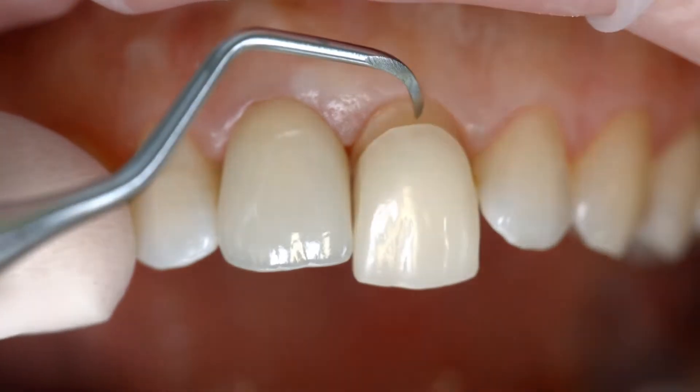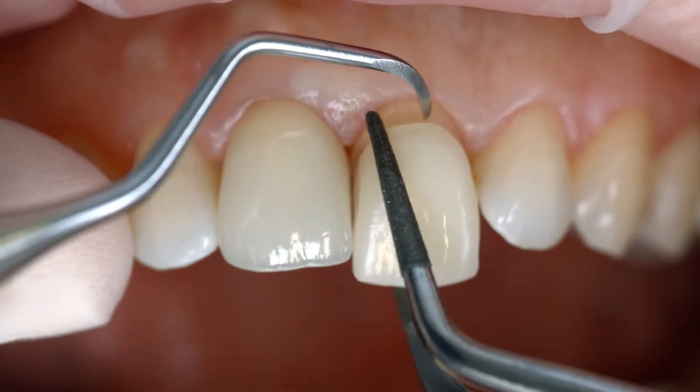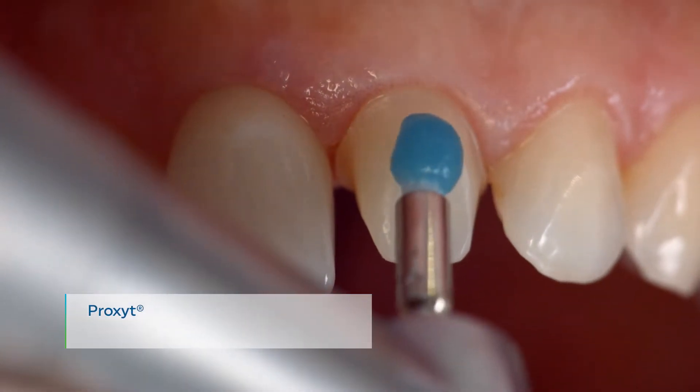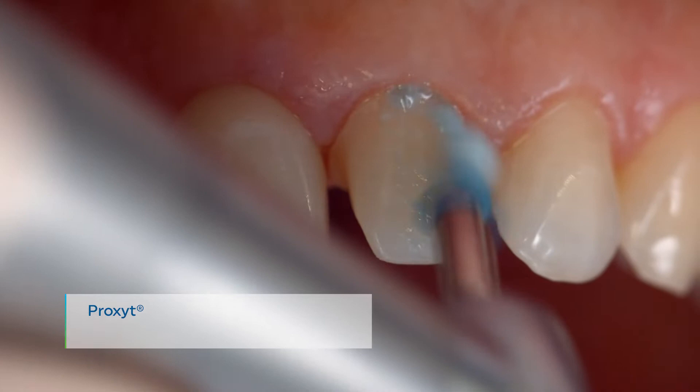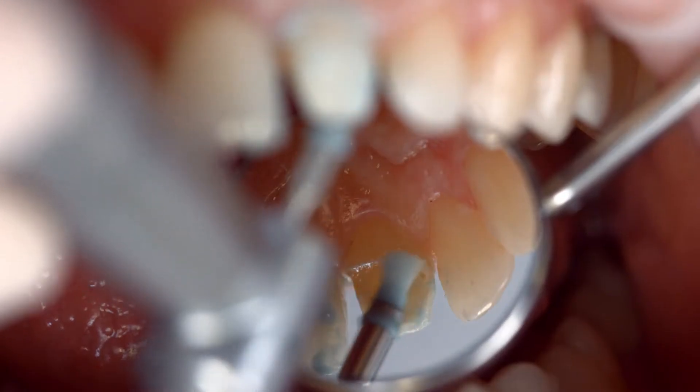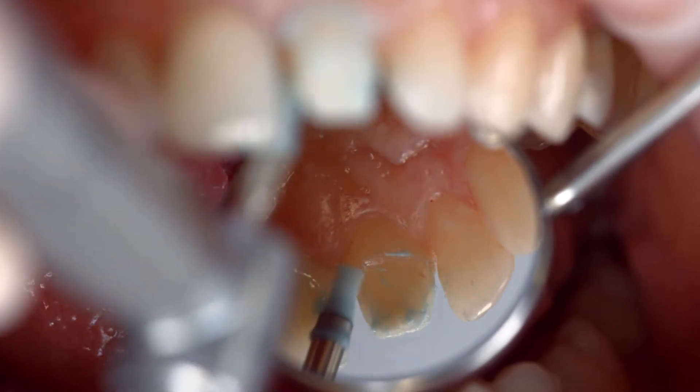Remove the temporary restoration. Clean the preparation with a polishing brush and fluoride-free cleaning paste such as fluoride-free Proxit. This ensures that all temporary cement residues are removed.